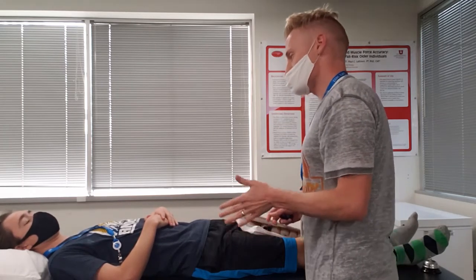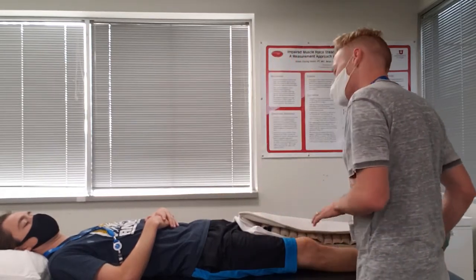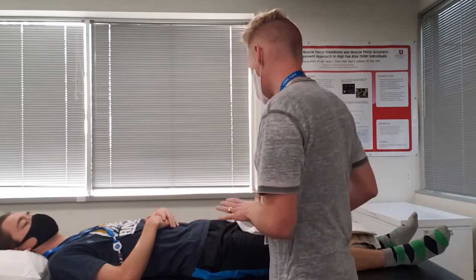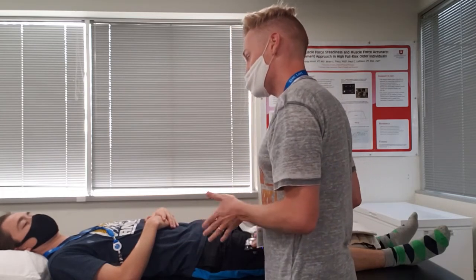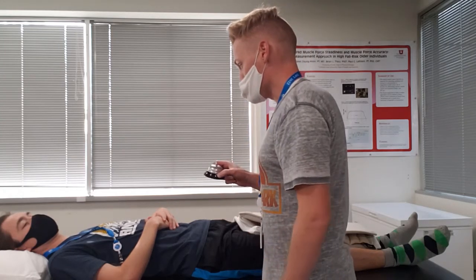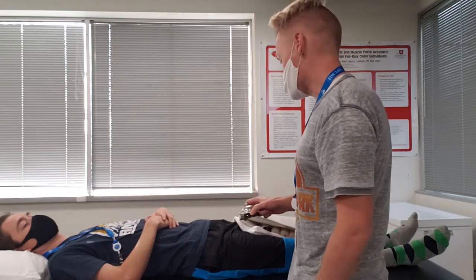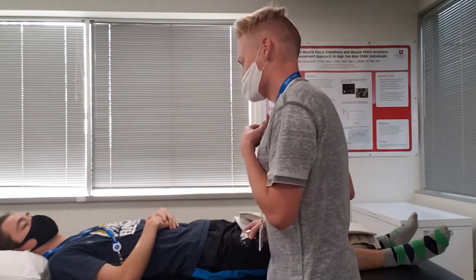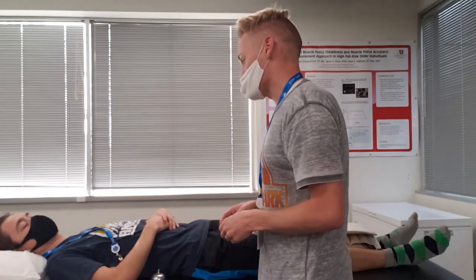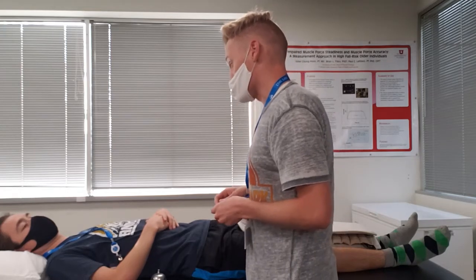It's going to start out probably not too hot yet, but it's probably going to get pretty hot. Just let me know if it's ever too uncomfortable for you. We want to make sure it doesn't lead to burns, so if it's feeling like it's burning or too hot, go ahead and ring this bell or call for us. If for whatever reason nobody answers, just kick that heat pack off onto the floor. I'll be checking on you about every five minutes. We're going to do this treatment for about 20 minutes.